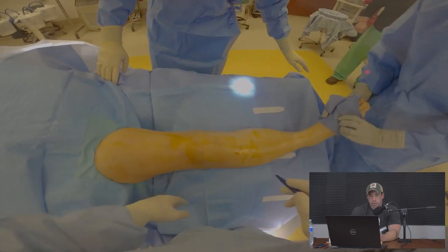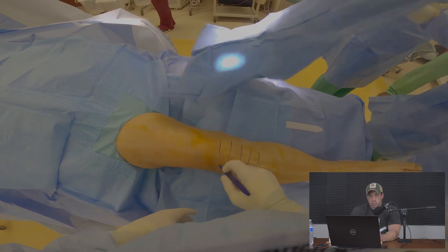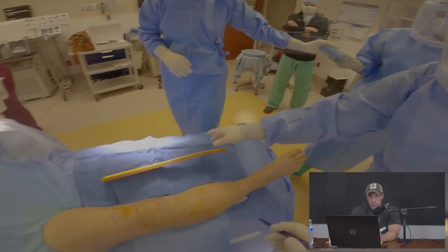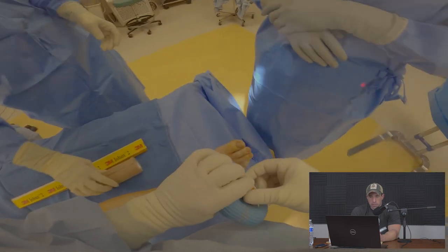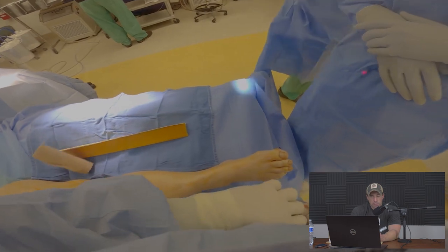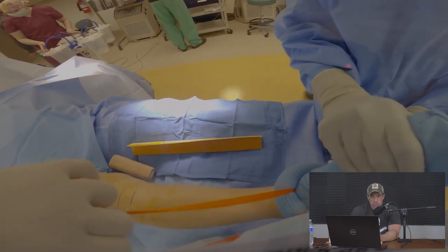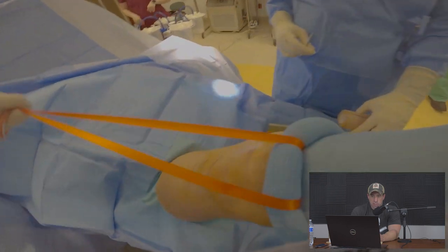These cutting blocks are produced with 3D printing and are specific just to this patient. The skin has been prepared to preserve sterility; we're making marks to ensure accurate closure by lining up the skin edges. We're applying a tourniquet to the leg — some knee replacements are done without one, but for this procedure we used one.